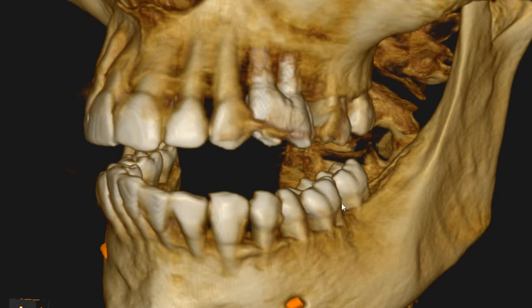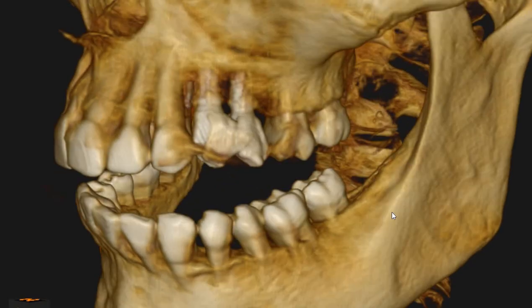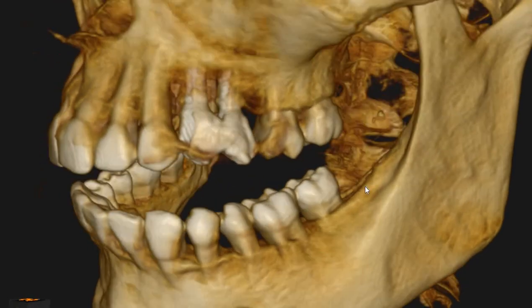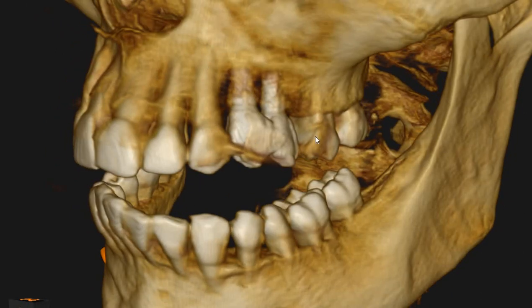Hello and Assalamu alaikum. Ultrascan Diagnostics here. This is the CBCT of the patient which you had requested. The area of interest is the 3, 4, 5, and 6 region.